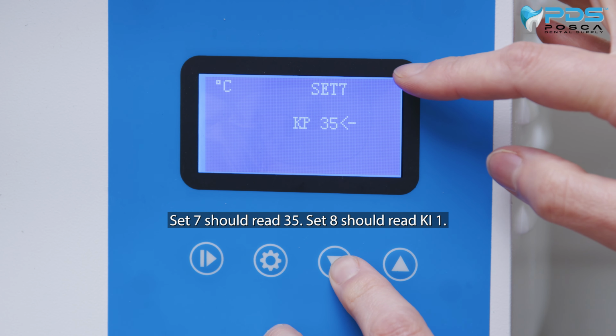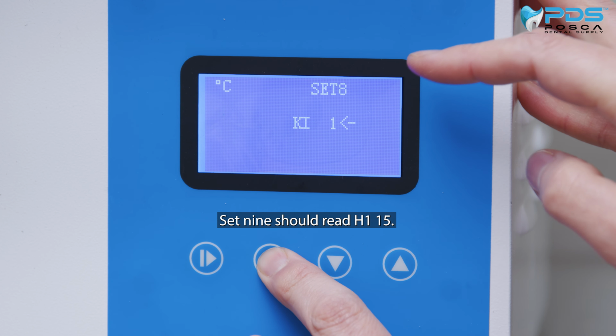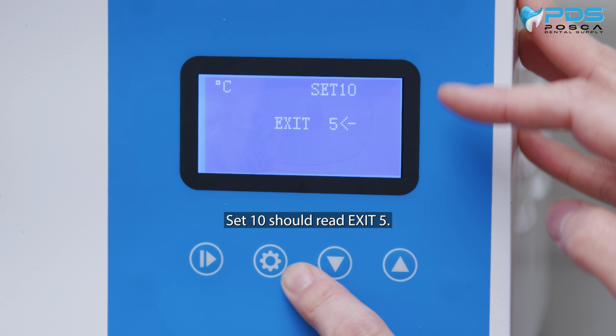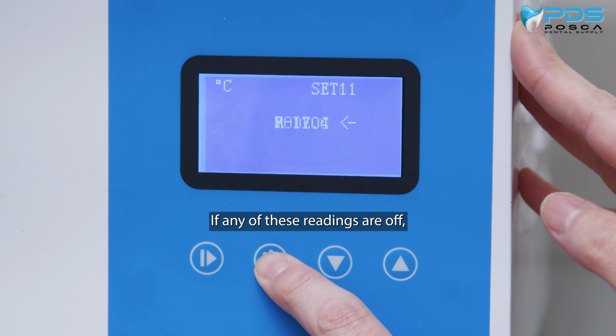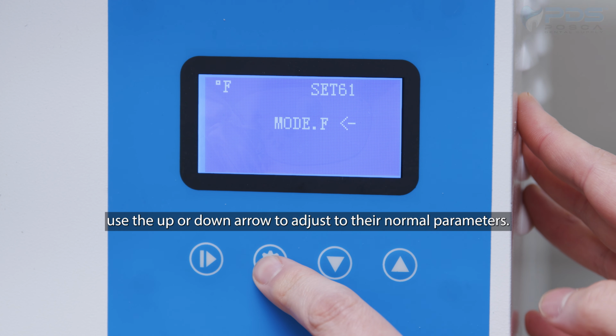Set 7 should read 35, Set 8 should read KI1, Set 9 should read H115. Set 10 should read Exit 5, Set 11 should read R1704. If any of these readings are off, use the up or down arrow to adjust to their normal parameters.